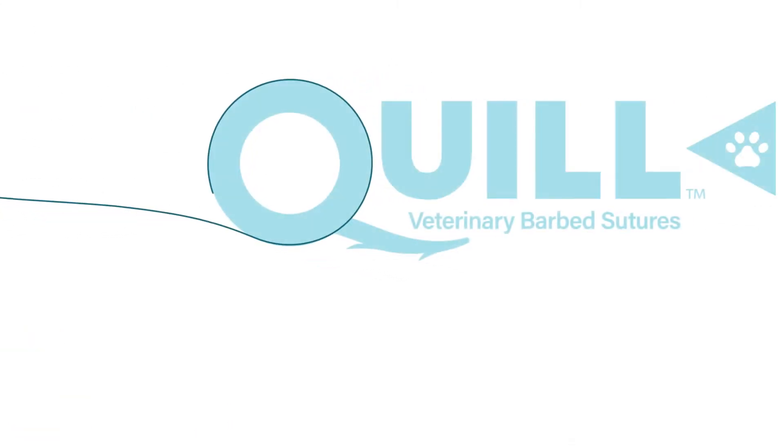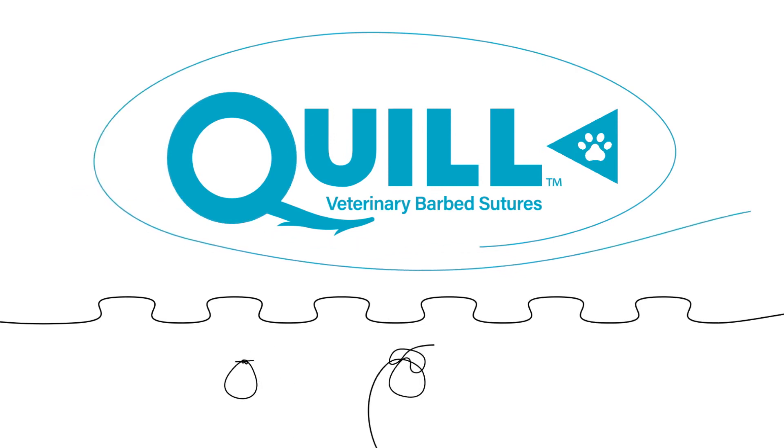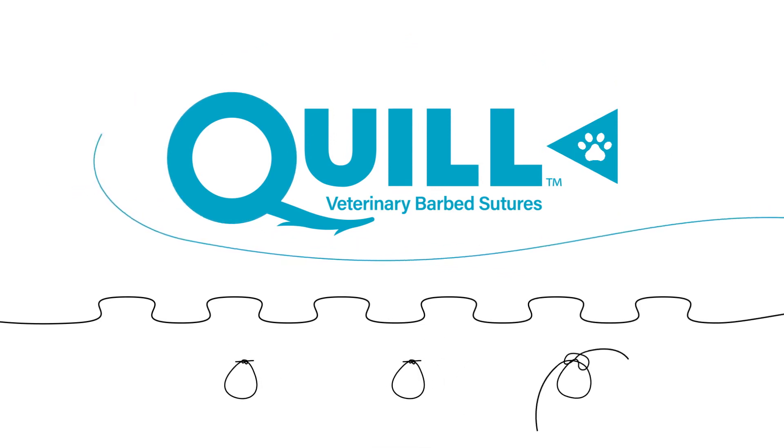To solve this, Surgical Specialties developed the Quill Veterinary Barb Suture, giving you the speed of a running stitch and the security of an interrupted stitch without relying on knots to secure the closure.